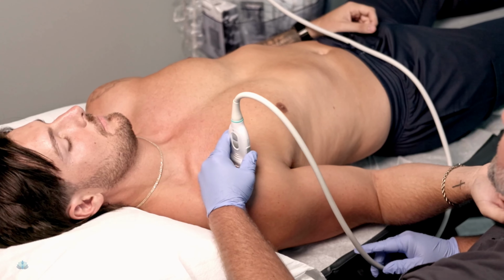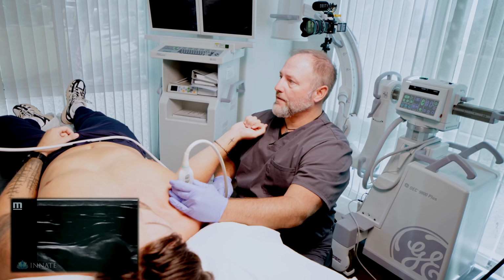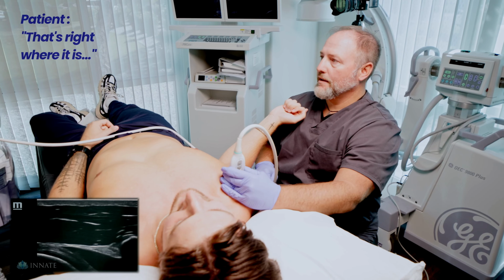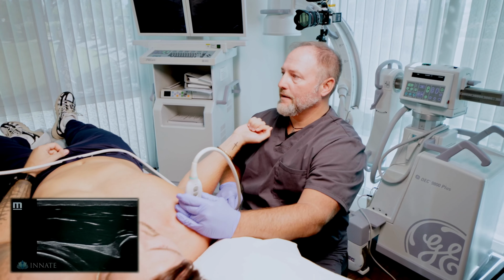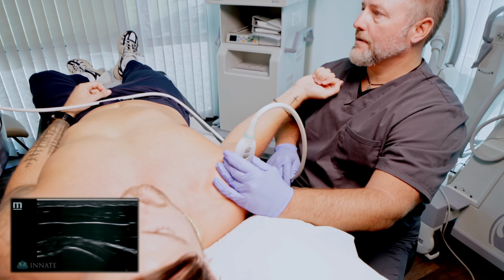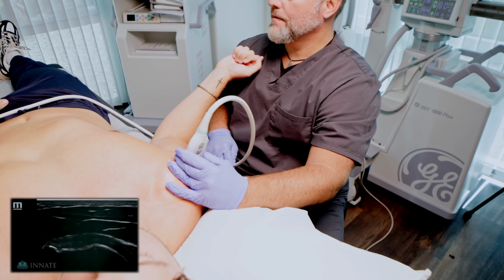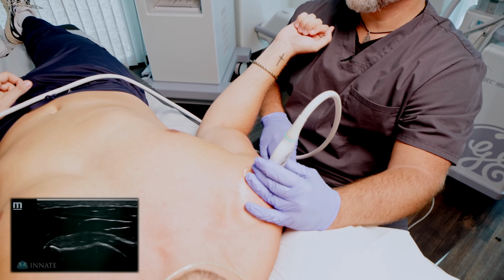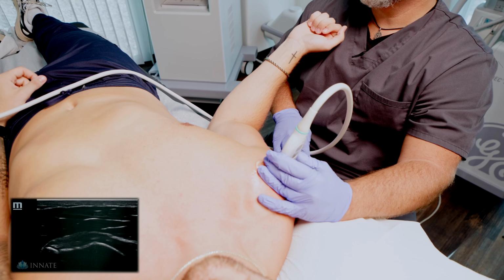So I'm going to be placing the probe here and getting a good view of that area of pathology right where it is. I want to get a good spot here again. There's a subscap. So I'm coming around. And there's some of those little cortical irregularities that we could see in the bone.